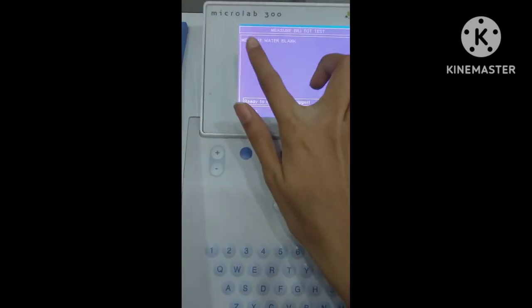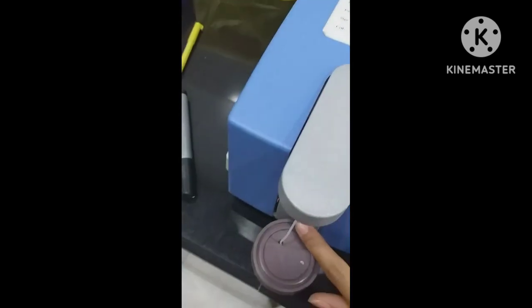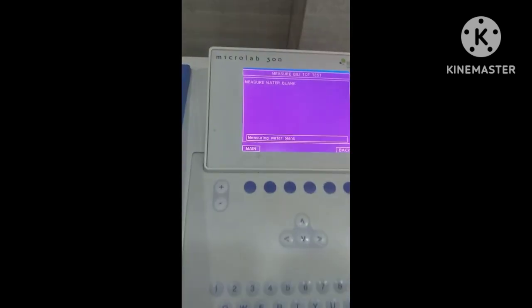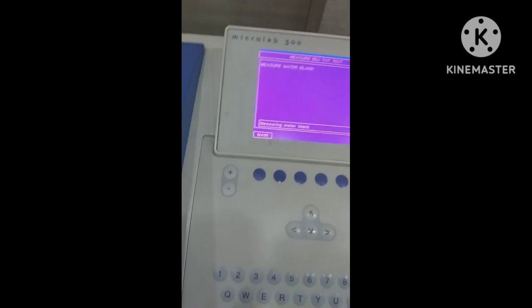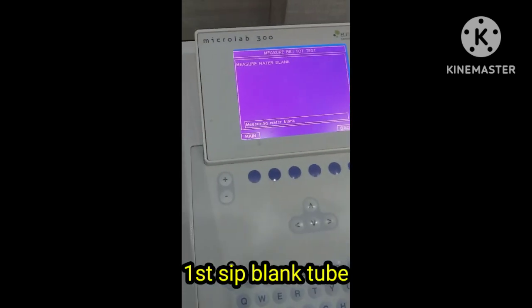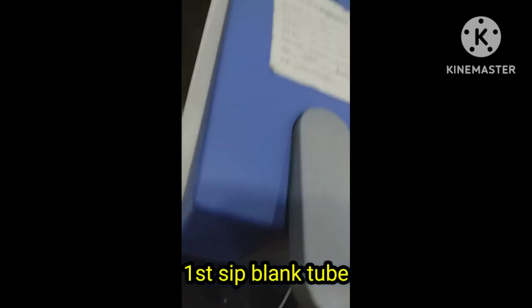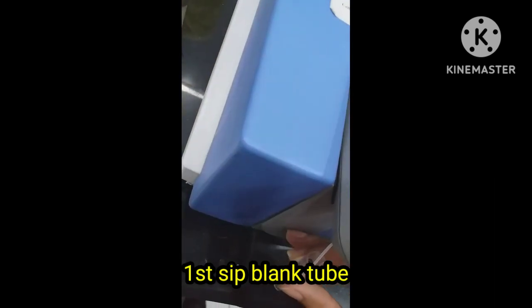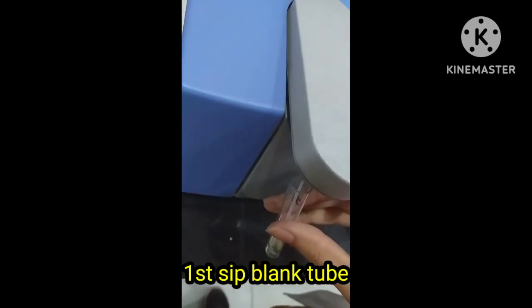First, the machine says to make water blank. So we will sip distilled water and it will start making the water blank. Its value should be 0.0 mg/dL. After calculating the water blank value, the machine will say to sip the blank tube, so we will sip the blank tube and after some time the blank tube value will appear.